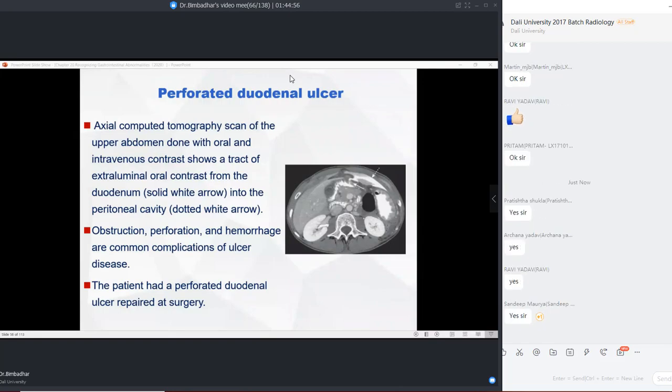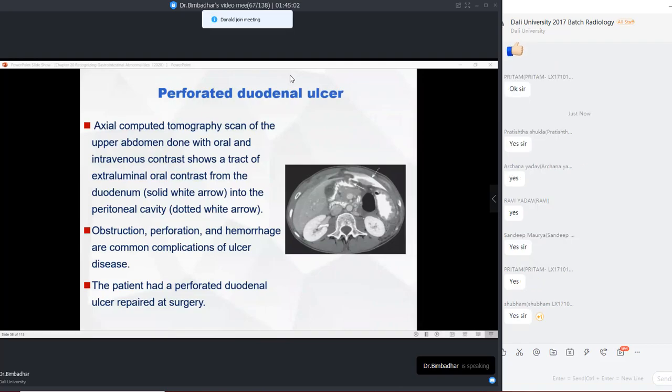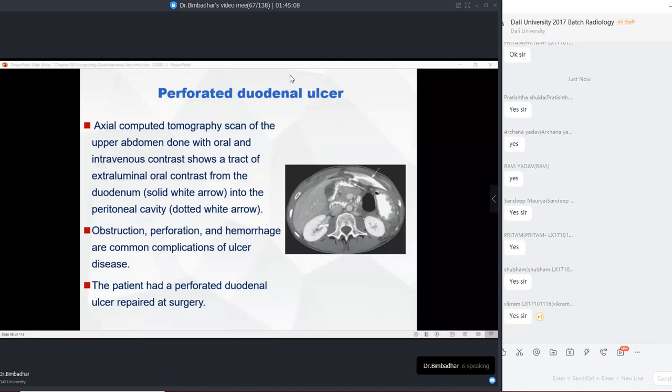Yes. Okay. Let's try to understand one simple thing. Actually, I've been looking at a case, but I think I will share it with you so that you can understand. Let me give you a history first so that you can see it's a real clinical practice case, so that you can try to analyze. It's not related to the abdominal system, but it is related to the chest.